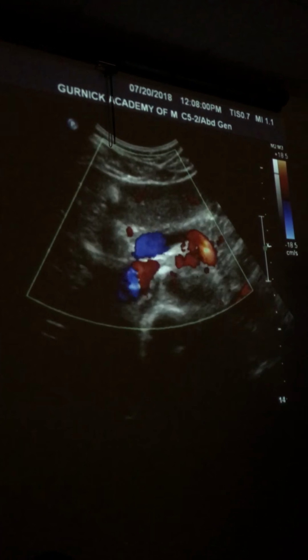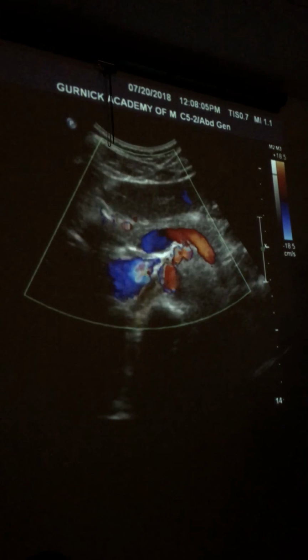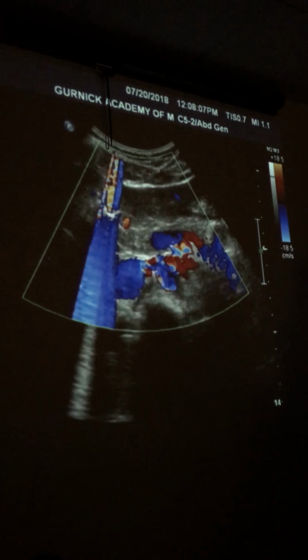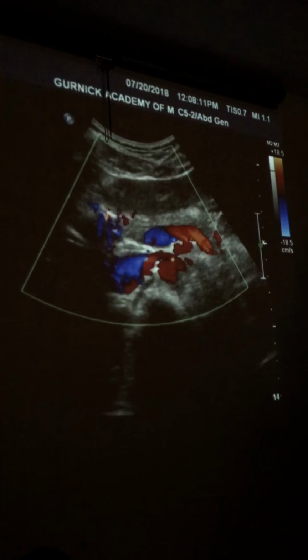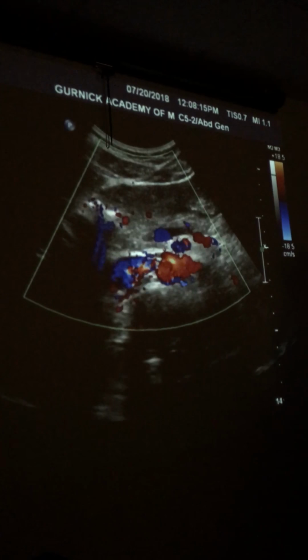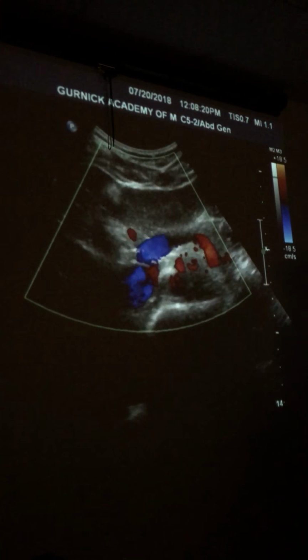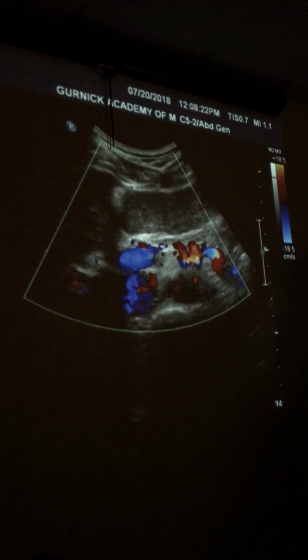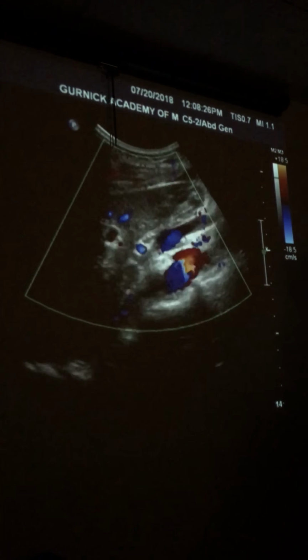Okay. And in most labs, you're not going to be looking for the SMV unless you're working at a vascular lab doing mesentery studies. That's usually when you're going to need to find this, or when you come to Wayne's Master Scan Lab on Saturday when we do the abdomen. That's when you're going to see it. Now, if I scoured it, Lindsay, the answer is maybe. Like I can see a little bit of red right there, but usually no, and I'm not usually looking for it either.